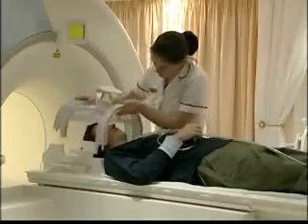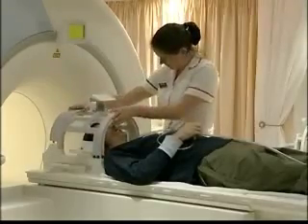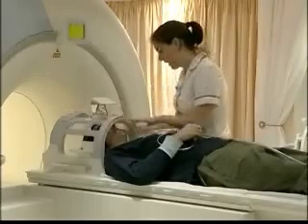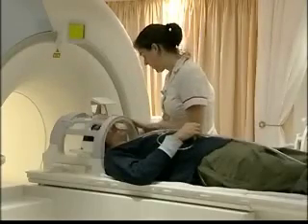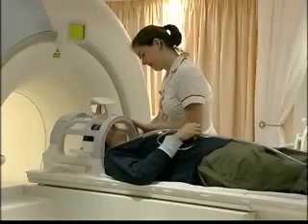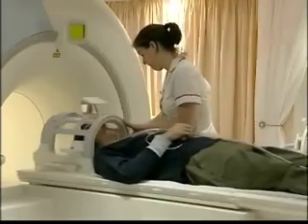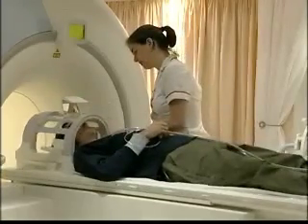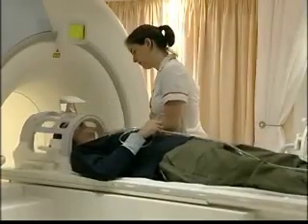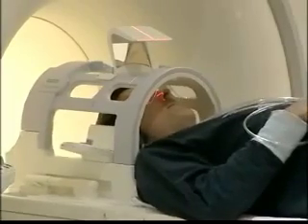When imaging small parts of the body, specialised coils are used to detect the radiofrequency signal given off by the relaxing nuclei. Here a head coil is being used for this purpose. Laser alignment is used so that the patient can be moved to the correct position in the scanner.